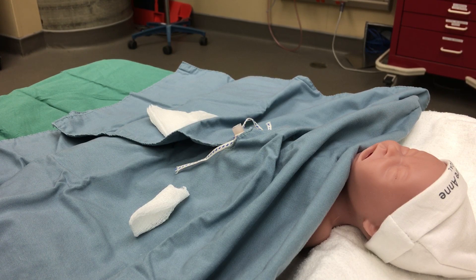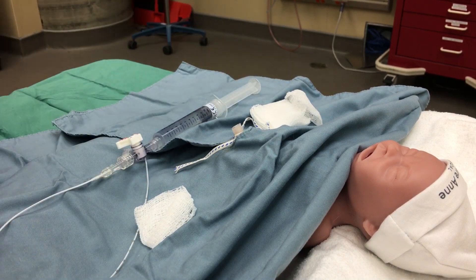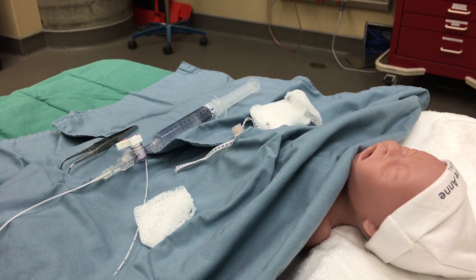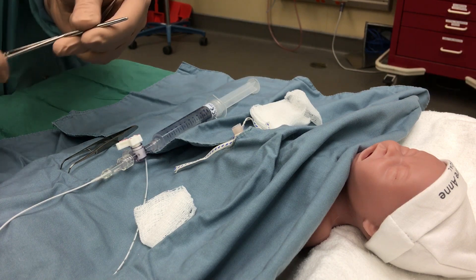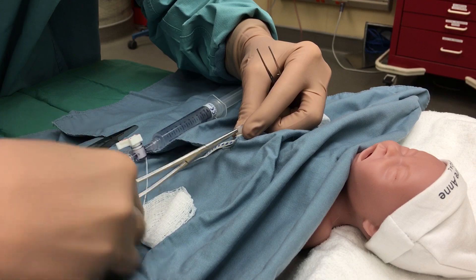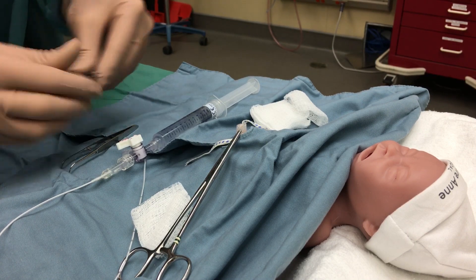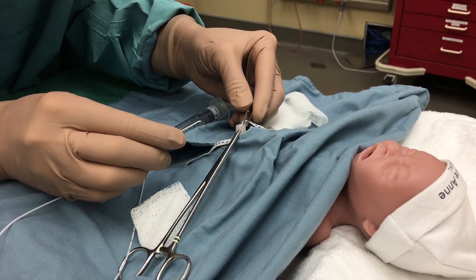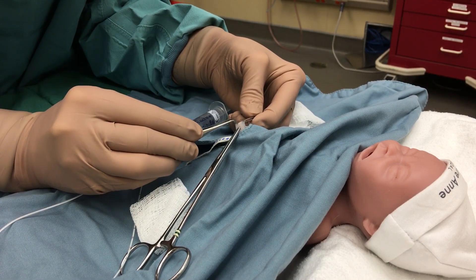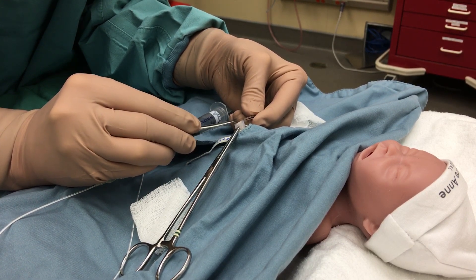We want to prepare to cannulate the artery first, so we get our equipment on our sterile field and prepared. We want a mosquito forceps first to stabilize the cord, and an iris forceps in the other hand. That helps hold the cord in place. Having located the artery, we very carefully — ensuring we don't make a false passage — dilate the artery.